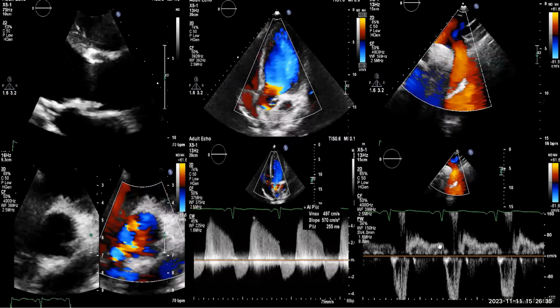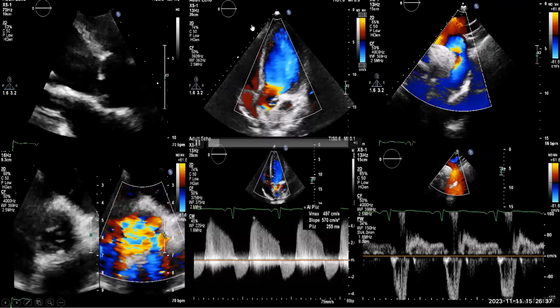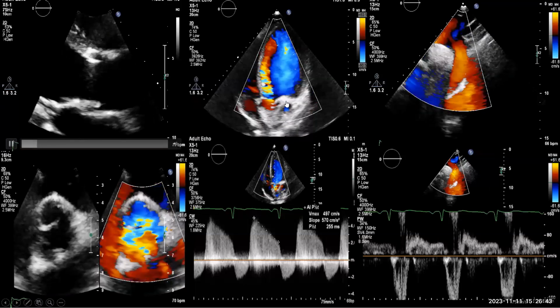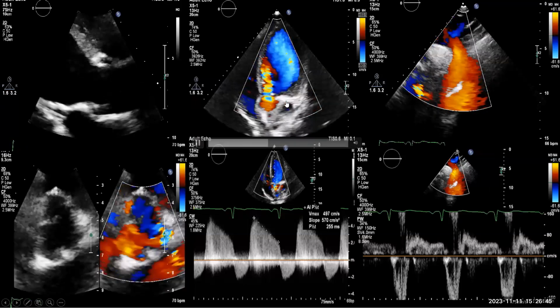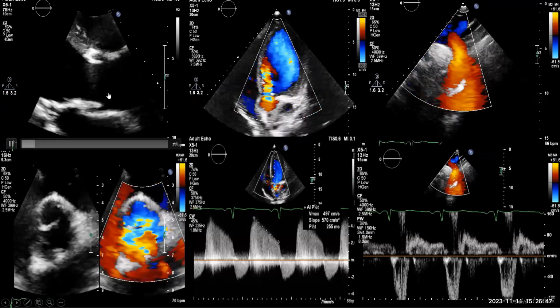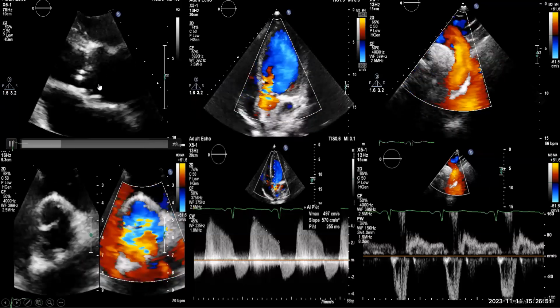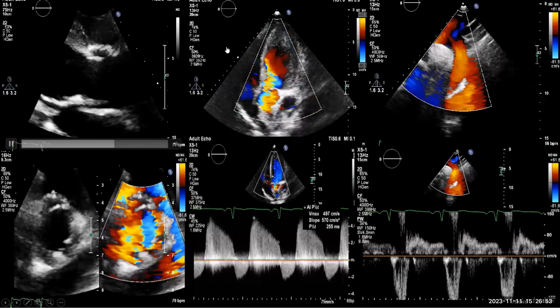And this is diastolic, holodiastolic reversal. Severe AR, severe AI. Why severe AI? I have told you many times you have to give me the etiology. You can see here, what's the problem here? You have vegetation and you have flail, okay? Vegetation and flail, excellent.